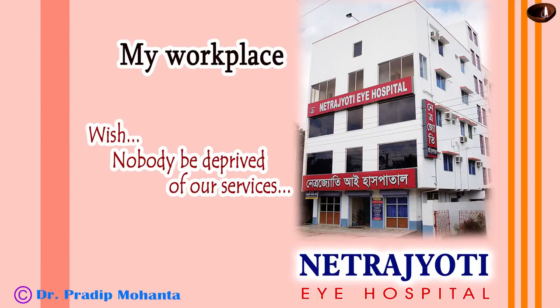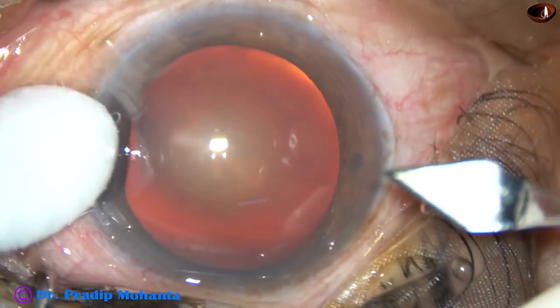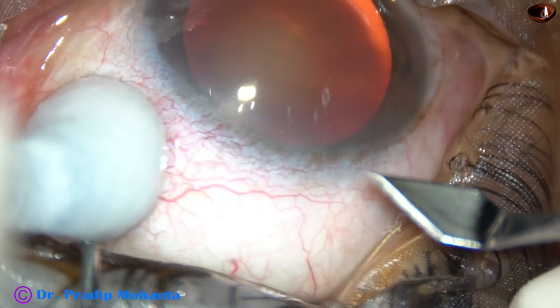Friends, welcome to my hospital at Rana Ghat, India. This is phacoemulsification of a cataract with grade 3 nuclear sclerosis.